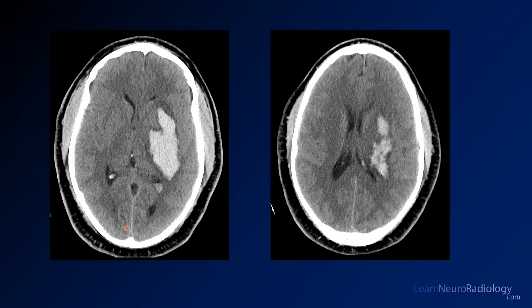Here you see the CT images. There's a hemorrhage centered in the left basal ganglia and thalamus, dissecting along, with some blood in the left lateral ventricle — so it has dissected into the ventricle a little bit. That's relatively common for these kinds of cases.